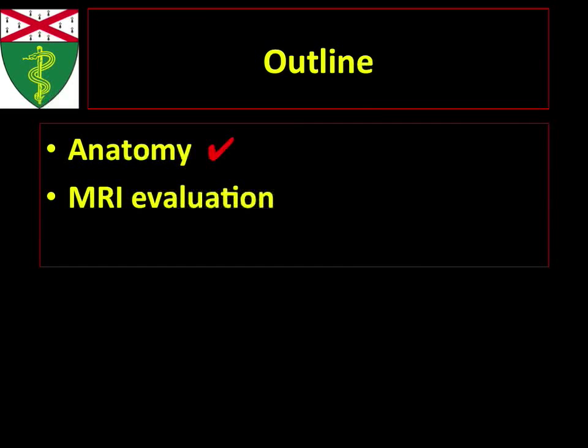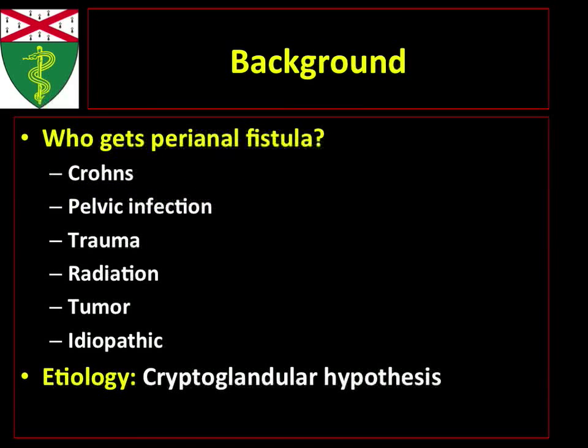MR is really the standard of care to evaluate these things. Occasionally you may get cases where you have to inject these fistulas under fluoroscopy and see them, but I haven't had to do one, I don't think, in a long time in my training. Nowadays we get asked to evaluate this on MR a lot, and it's really because MR has amazing soft tissue resolution. You can really see these things very well.